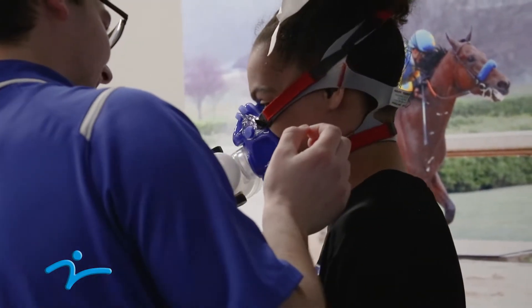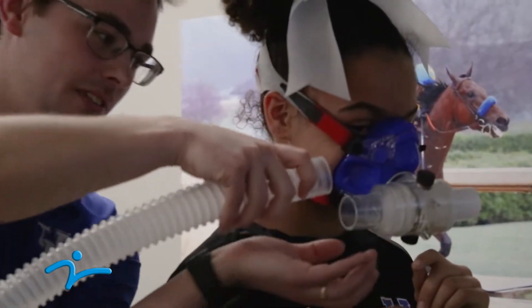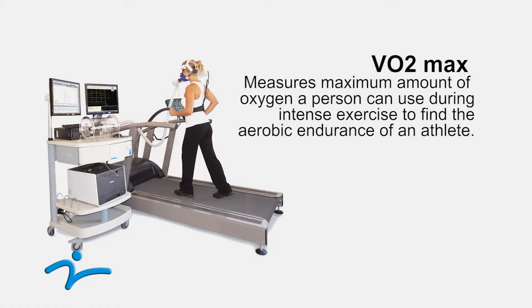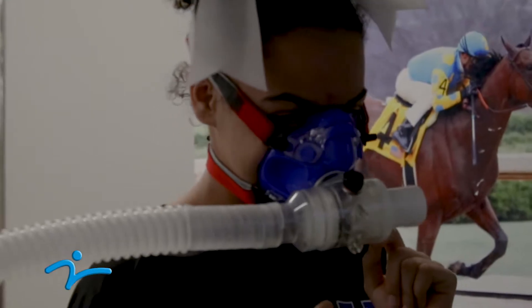Does that feel okay? Not too tight? All right, then you can go ahead and face this way. I'm gonna hook this tube up right here. So what we do here is we do what's called a VO2 max test, where you can actually measure the maximum amount of oxygen you're able to consume when you're running. We hook them up to the mask and then do a test where they run for as long as they can until they reach their maximum value.